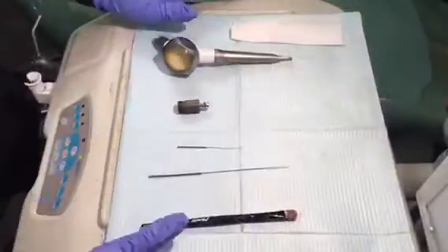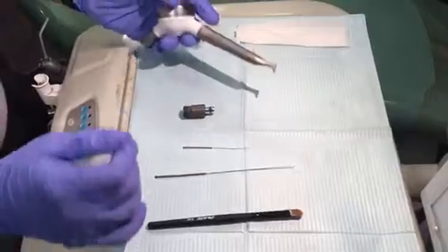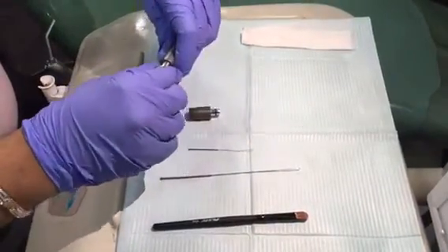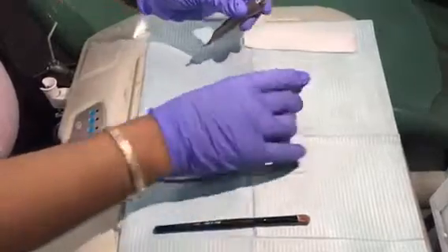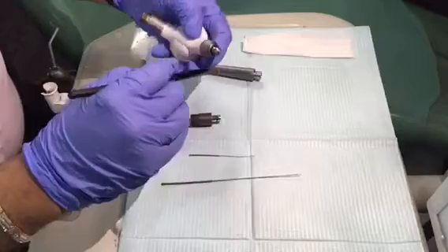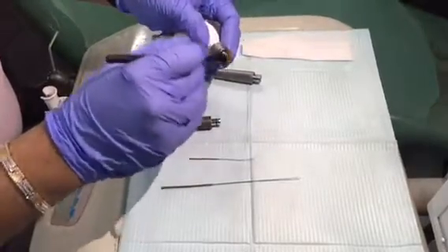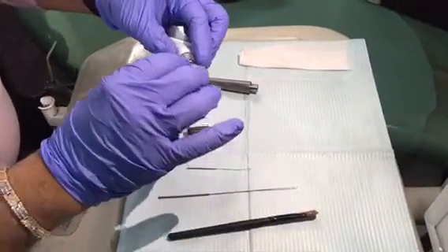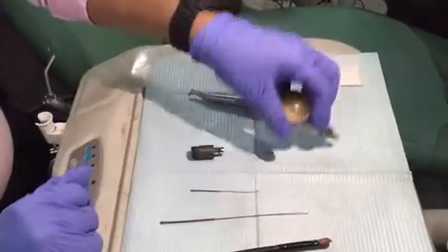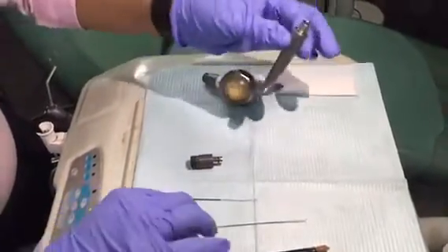This is all we get out of the box. Now this hand piece can be detached from the head like this. After you detach it, you need to clean all the powder contents from this area. After this is clean, in case you need, you can add a drop of oil here for lubrication.